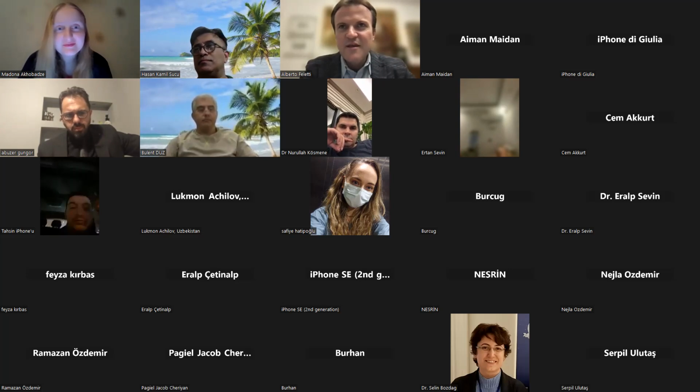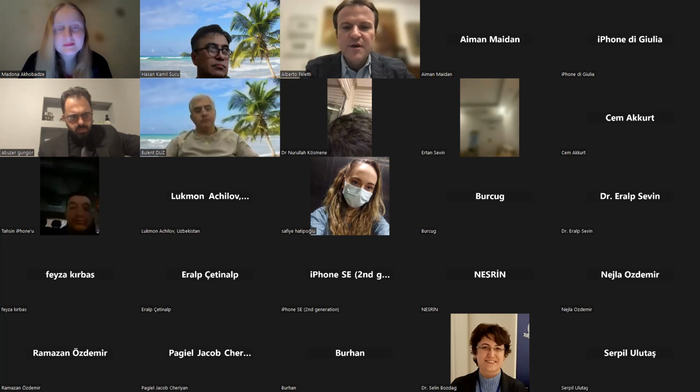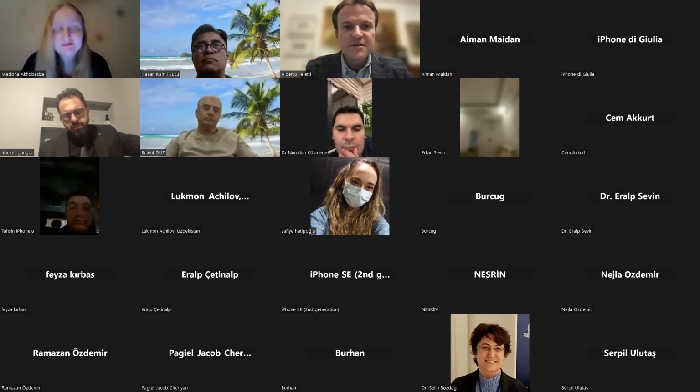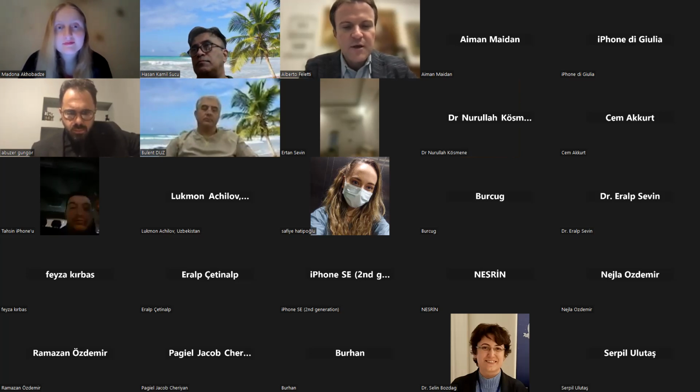Well, I think it depends because, as I showed you, with this kind of flexible endoscope I could go all the way from Kocher's point, the entry point, to the cisterna magna very easily. And with the endoscope, I have never had problems of damaging the cerebral aqueduct or the fornix.